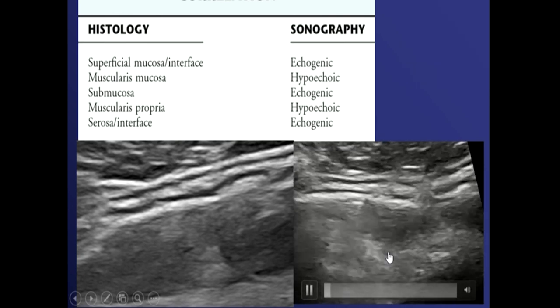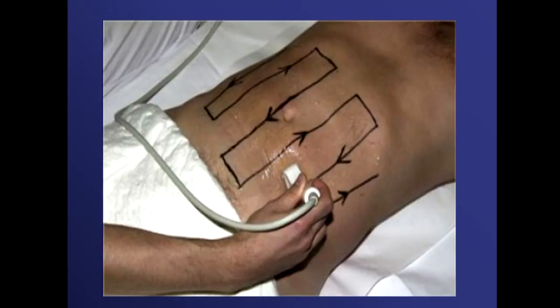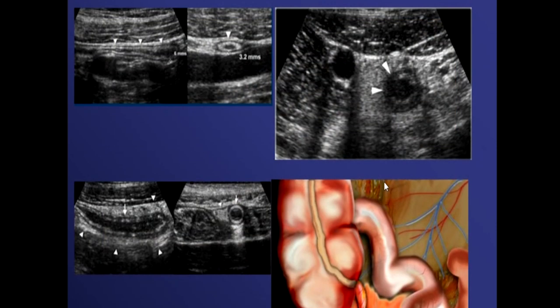When scanning the abdomen, we follow one pattern — scan the entire abdomen using a zigzag kind of motion so that you are not missing any part, scanning the entire abdomen systematically.